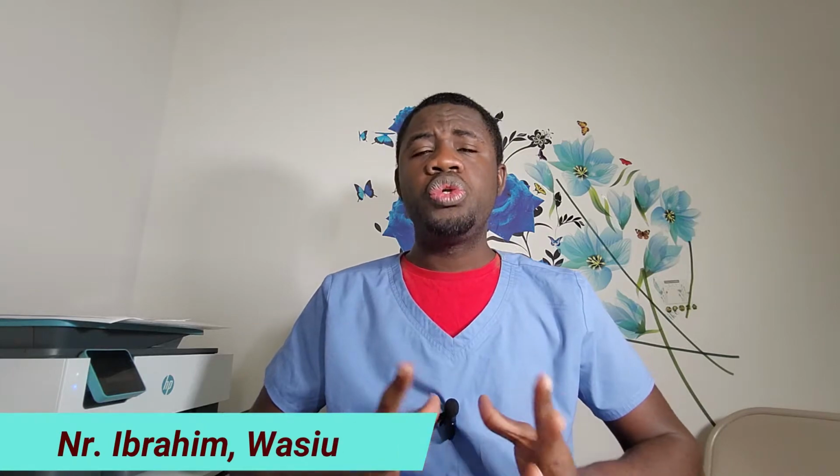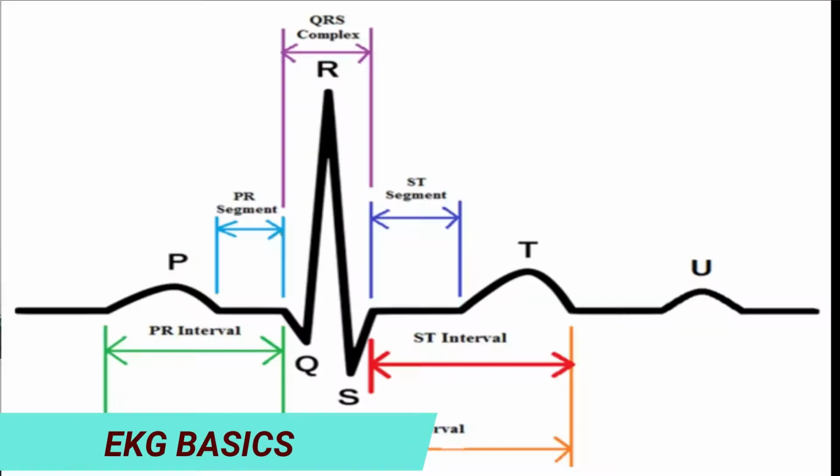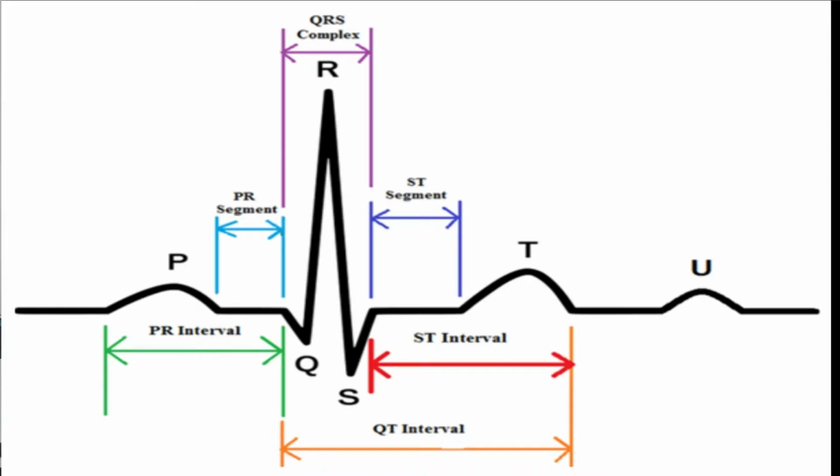Patients are often required to have an EKG to know how their heart functions, to study the electrical activity that goes on in their heart. Last time we discussed hemodynamics. Today we will go into the basics of EKG, how to read an EKG.